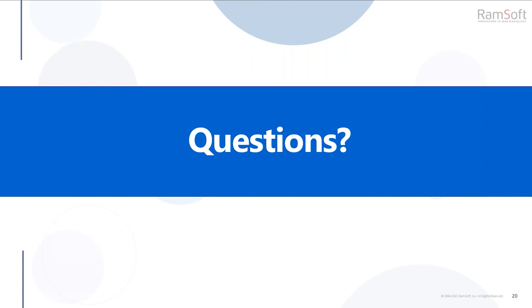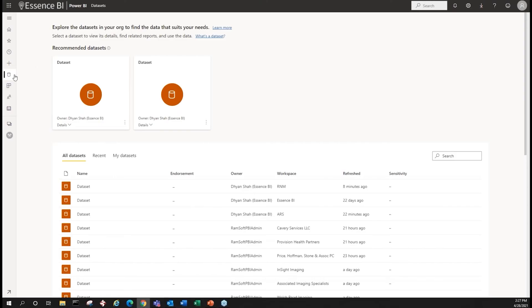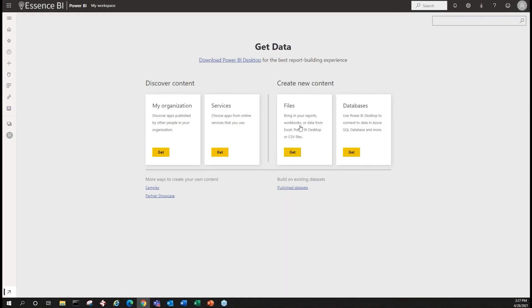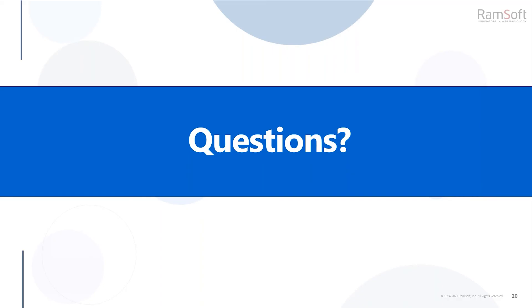Question: can we add new data sets? For data sets, you can come to where your data sets are and our developers have already added some. You can also go to 'My Data Sets', create a new data set, grab a CSV file off your computer, and import that as a data set into the software. You can then use that along with the RamSoft data when creating reports.